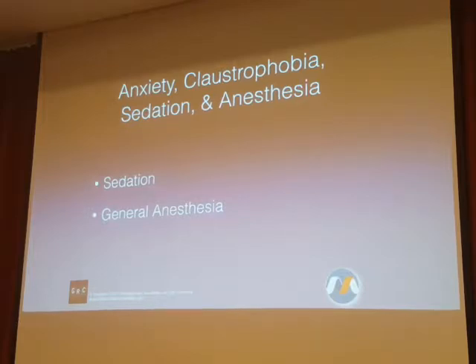When they come to MR and they dictate, or try to dictate, what piece of equipment they should use or whether it should be subject to screening, that is the equivalent of you walking into the OR and telling them that they have the wrong setting on the anesthesia machine. They wouldn't tolerate it if you did that, and they would be right to not tolerate it if any of us did that.